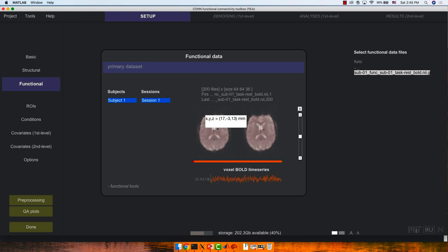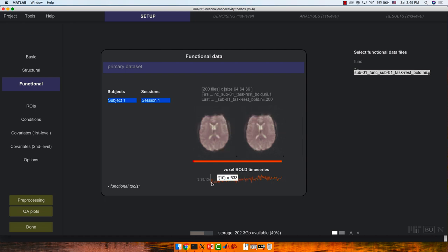There are other quality checks, but this is a default to help people identify motion. If you click anywhere in the image, you'll see a sample voxel time series. You'll notice if you click on certain voxels, you'll see trends in positive or negative directions — these seem to be caused by scanner noise of some kind. Later on during denoising, we'll be doing detrending — removing both linear trends. You can add more polynomial or quadratic trends. A good guideline is every 100 volumes, add another polynomial order to your drift removal.